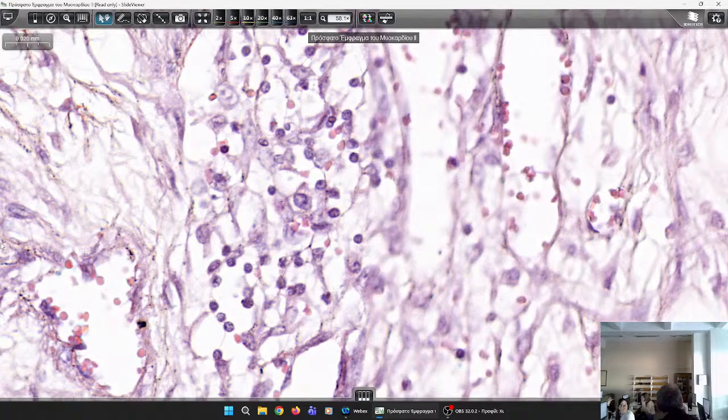So what do we see? We see all the evolution of the infarct, an old one from which the patient has survived, and a hyperacute one where the inflammatory cells have not yet infiltrated, and the recent one.